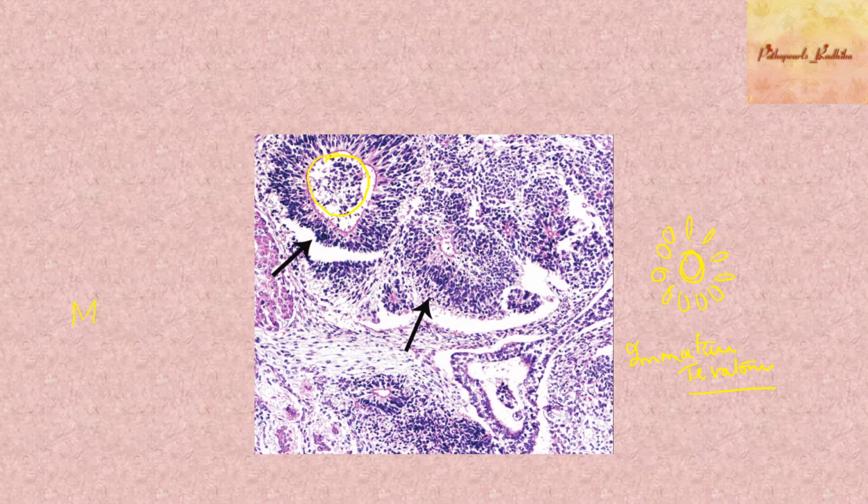Then I was telling something about a highly specialized or monodermal teratoma, in which you don't see cartilage, bone, or neuroepithelium. You will have one tissue component extensively. So you have a particular type where, if I don't tell you the site, you will call it thyroid tissue. You will see a lot of thyroid tissue in a tumor from the ovary.